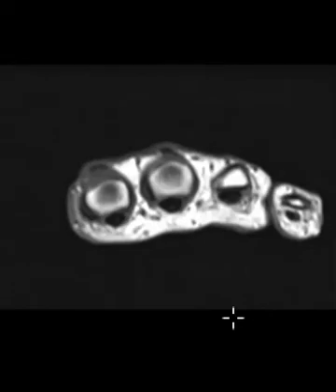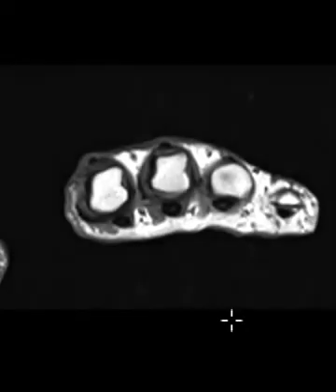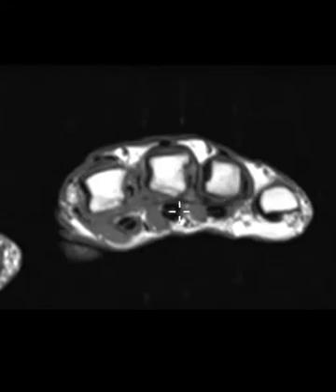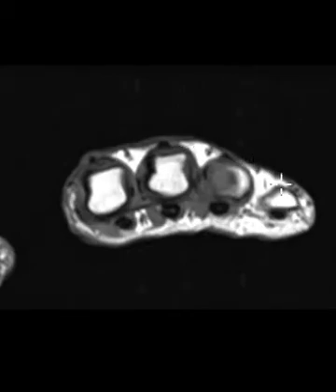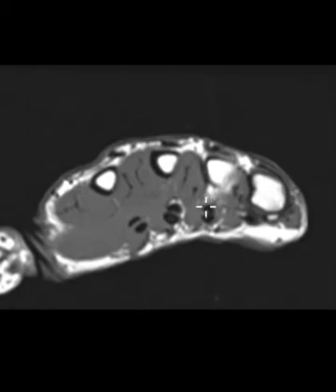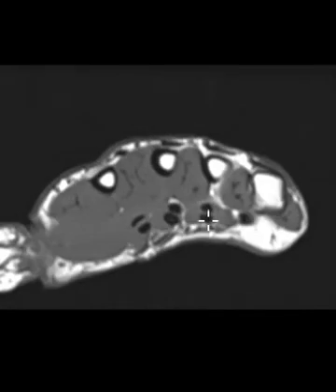So trigger finger is inflammation of the tendon sheath, and on this view, this is a short axis view where we see the flexor tendons over here in the palm. This is the second, third, fourth, fifth fingers. The extensor tendons are over here, the flexor tendons are here, and the flexor tendons are paired. We have a deep and superficial. So it's called the profundus, and this is the superficialis, the flexor digitorum tendons.